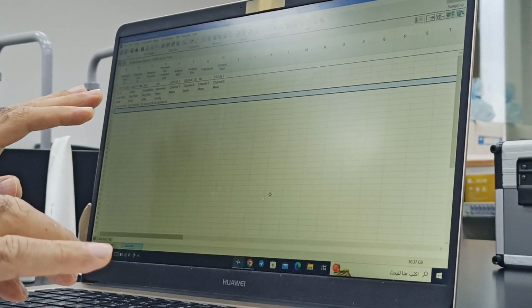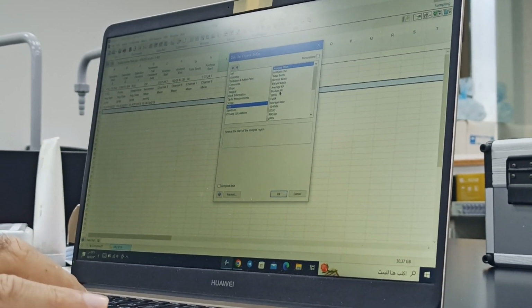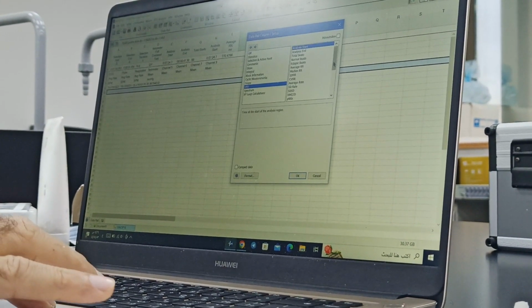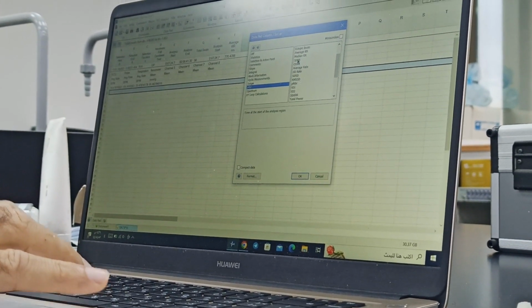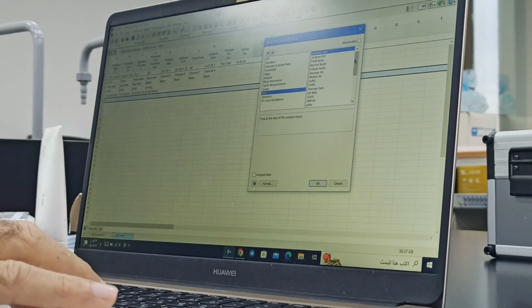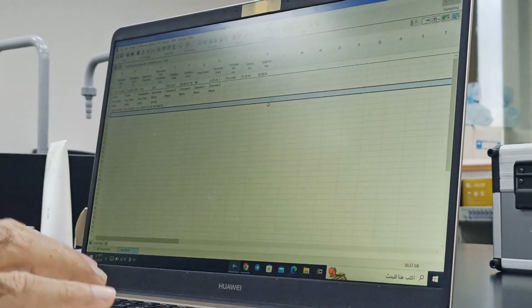Does it show the data we collected? It will show. Let me just say HRV, average RR. I will select 2 or 3 things. We go to HRV and go to SDRR. This is very important, we will be doing it all the time. And we go to RMSSD. Just for demonstration.